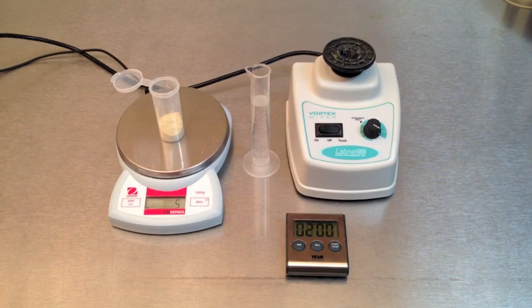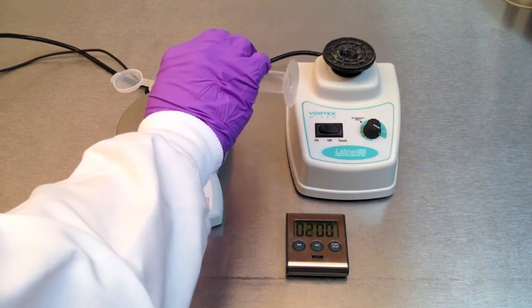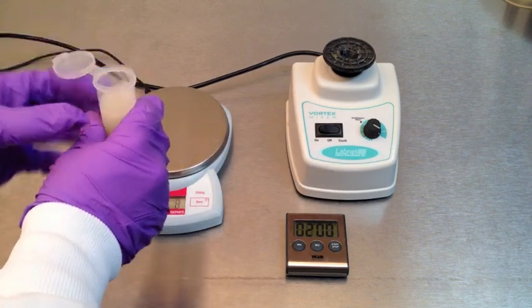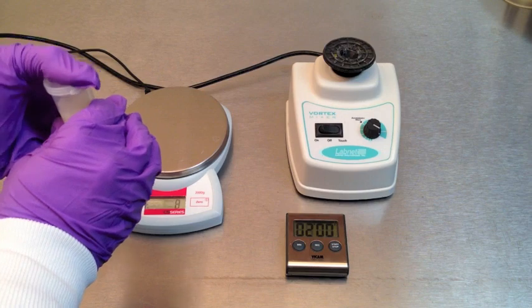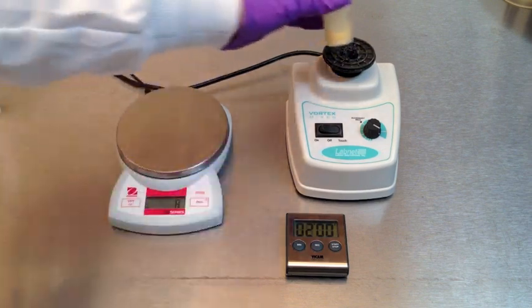Weigh 5 grams of ground sample and place it in an extraction tube. Measure 25 milliliters of 70% methanol with a graduated cylinder and pour it into the extraction tube. Cover the extraction tube and vortex the mixture for 2 minutes at maximum speed.